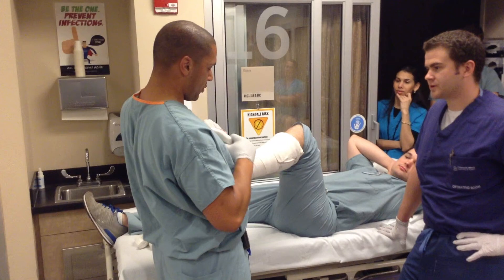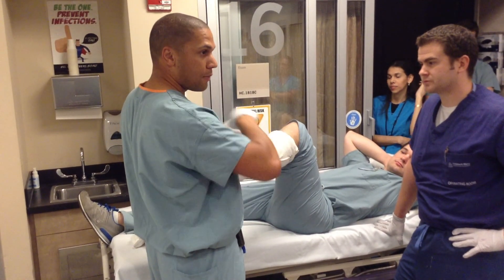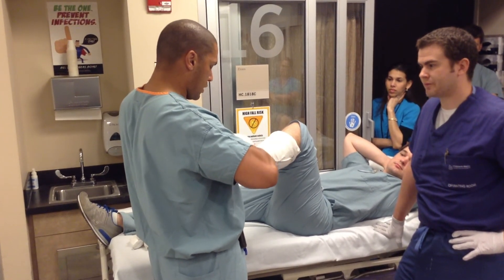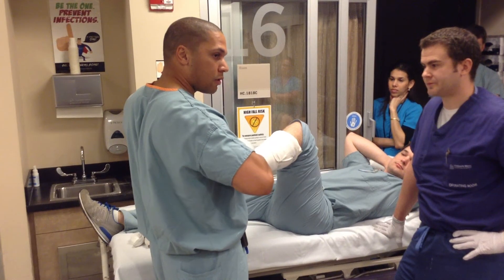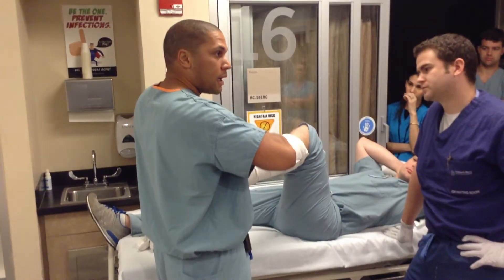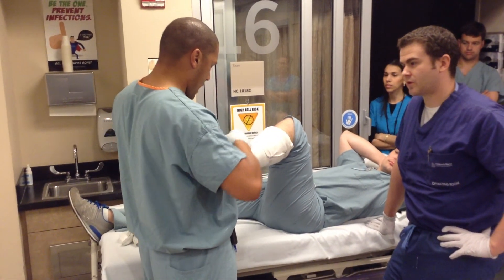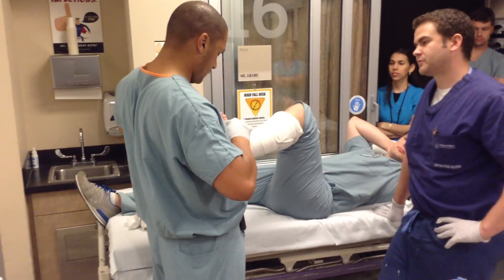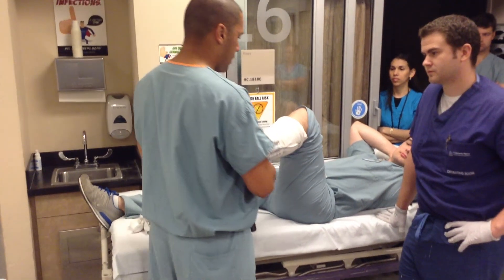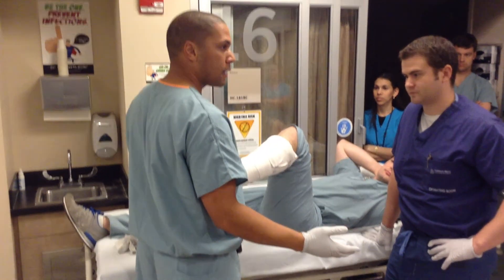Down here at the toes, he's got his foot plate there. Make sure the plaster is not wrapped around his toes. Wrap the ace bandage around and make sure the soft roll isn't constricting — stick your fingers in there and pull it apart. He can see all his toes, you can see all his toes. If you come back in, there are no piggies missing, so we can make sure they're all intact and their sensation is good. And that's it — we'll just sit here until it's dry. That's the AO splint.